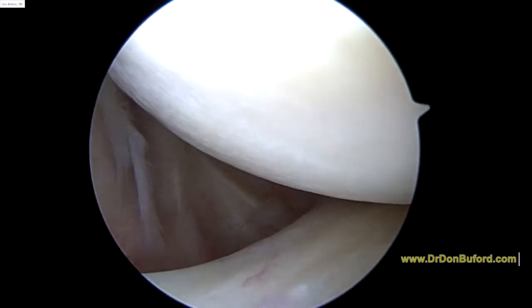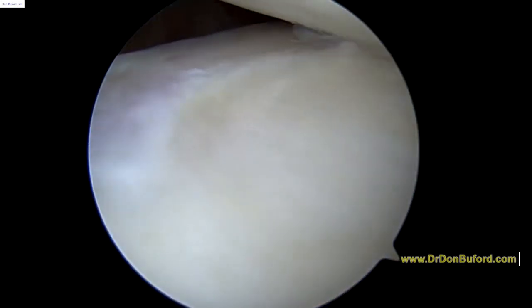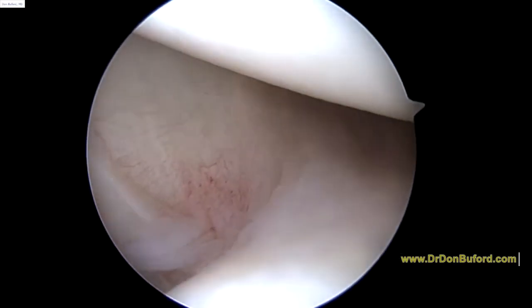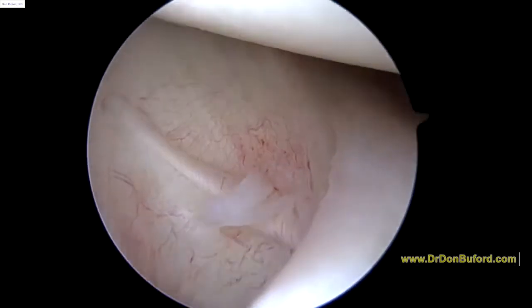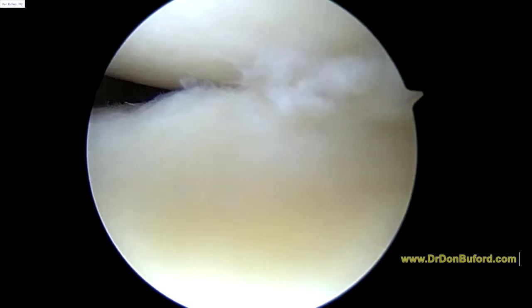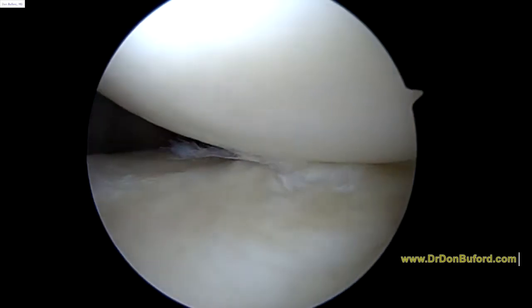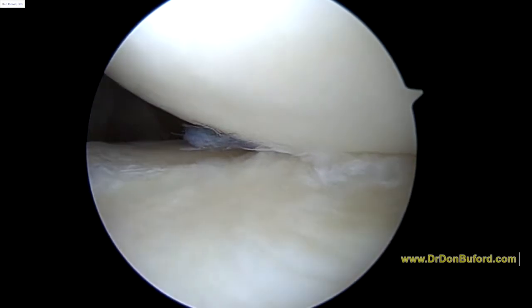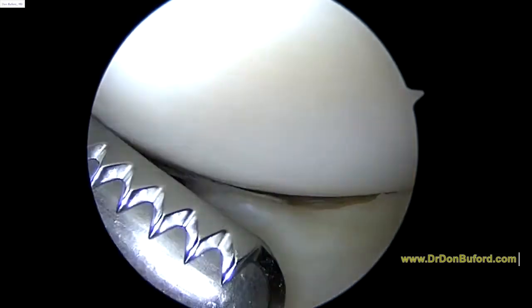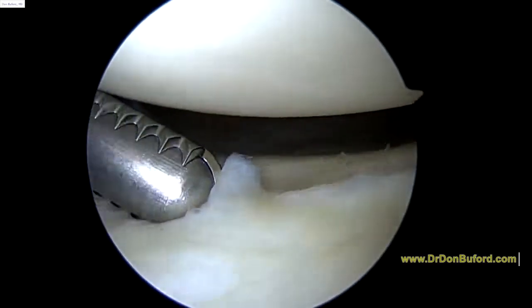Now we've moved to look down the front of the shoulder. This anatomy actually is pretty good, but I'm seeing significant problems with the ligaments and the anatomy here. That's the anterior band of the inferior glenohumeral ligament. You can see a little bit of cartilage damage there. The bottom of the glenoid — see how loose that is.